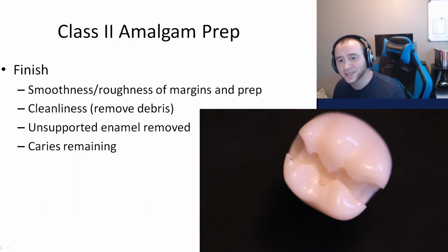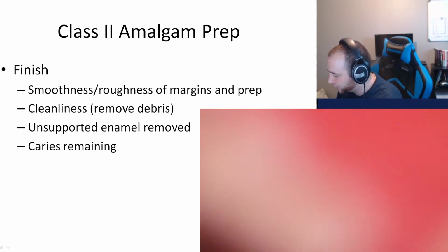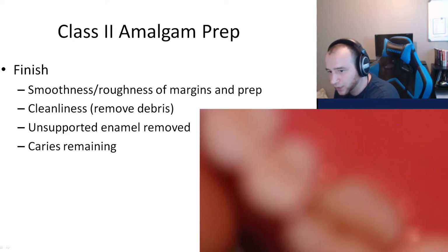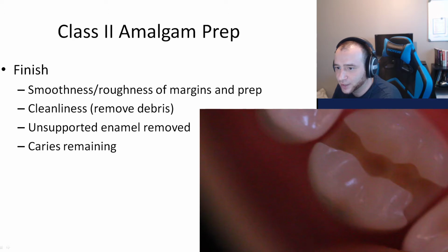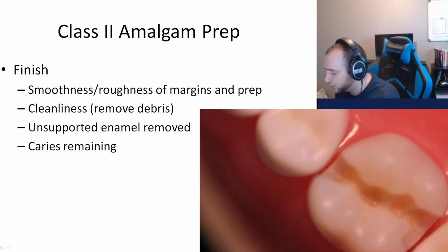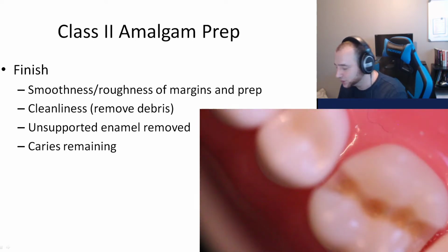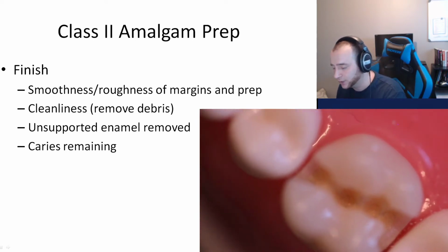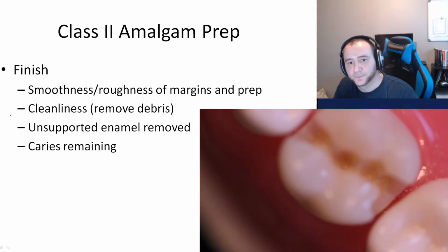The other one is caries remaining. I don't have one with caries in it, I'll try to bring one for another video, but for now, you want to make sure you do not have any caries remaining in the tooth. And not only that, anything that looks like caries as well. These Kilgore teeth will have dark spots in them that represent carious lesions, and you have to remove them. Okay? So let's go through these and how to get an A.